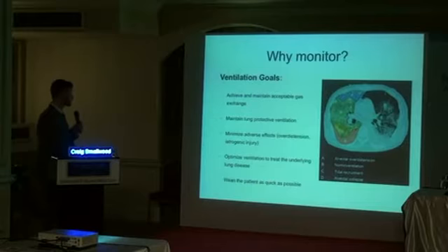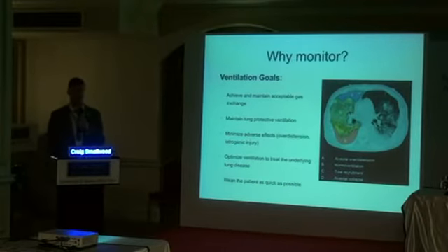And we also want to wean the patient as quickly as possible. So once they're healthy, we don't want to waste any time on the ventilators, because time on the ventilator is bad. Opportunity for ventilator-associated events or pneumonia, and also injury by pressure or ventilation.